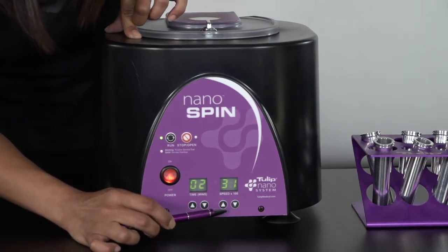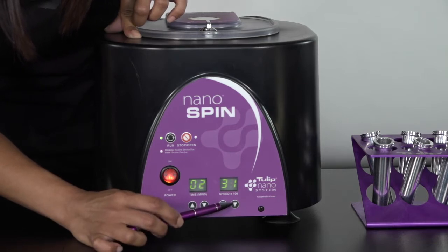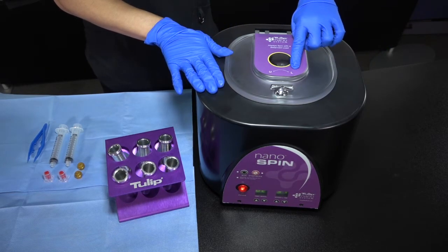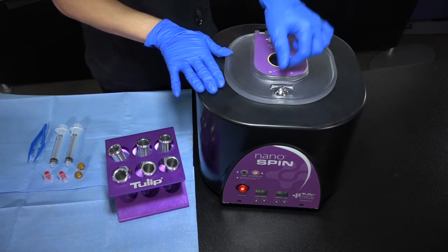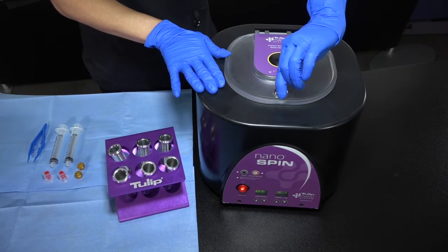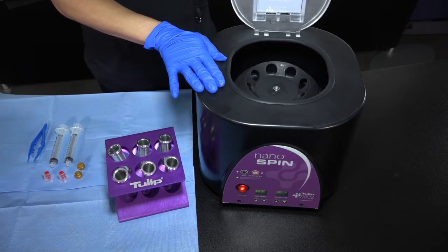On this end, you have the RPM times 100. To adjust, use the up arrow to go up in RPMs or the down arrow to go down in RPMs. The top of the centrifuge is fairly simple — L for lock, U for unlock. Simply turn it toward the L to lock. To unlock, turn the opposite way and open it up. And there you see the chamber.